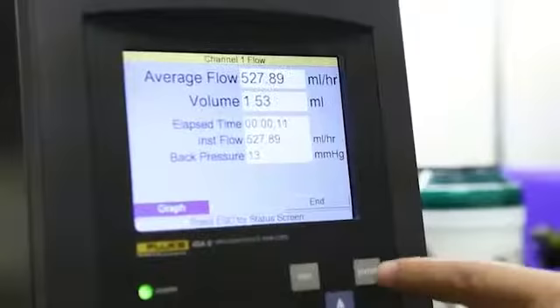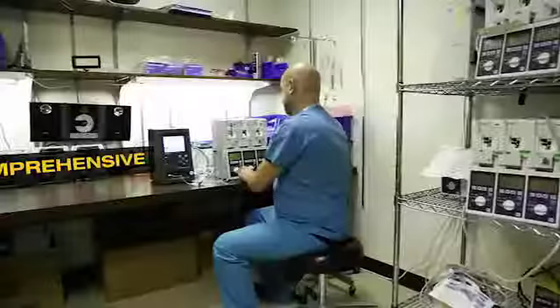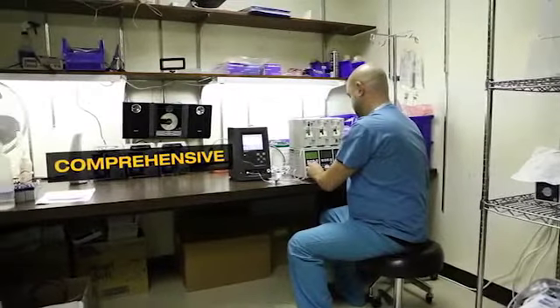You can precisely see what is the volume, what is the flow, and what is the pressure. And then you know if the pump works right or not.